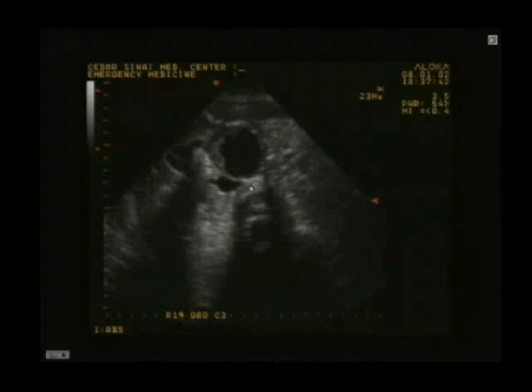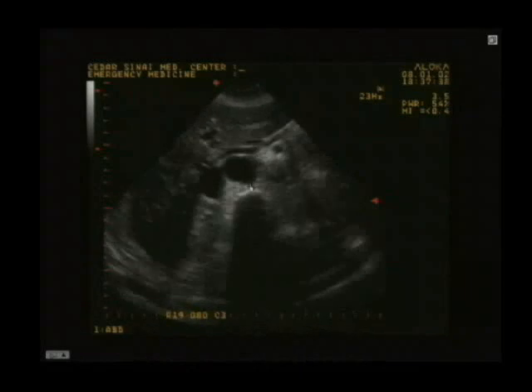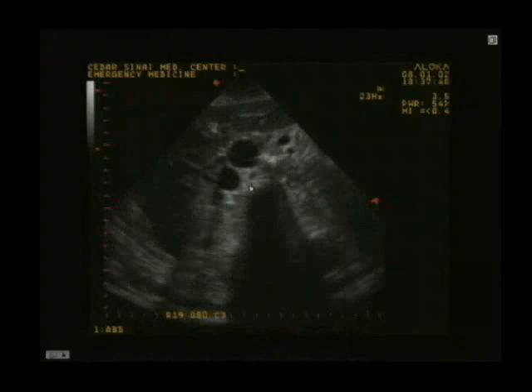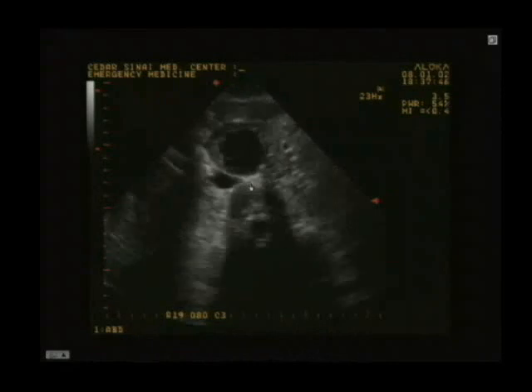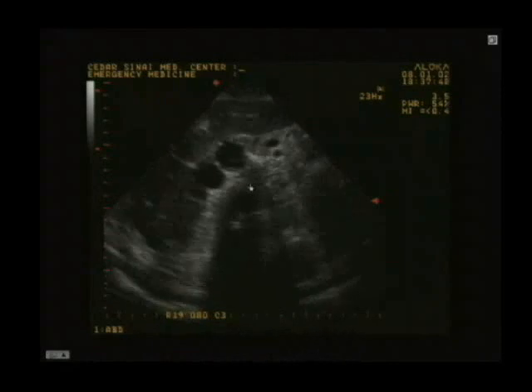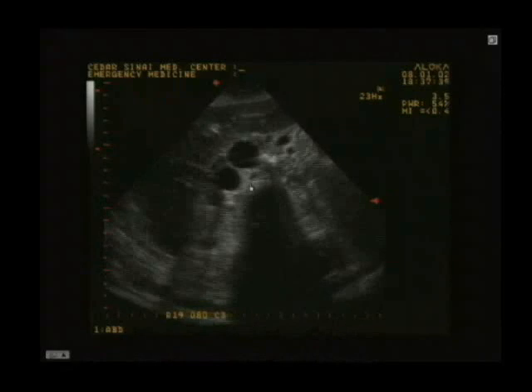And these are really satisfying cases. Sometimes these are cases that you weren't even suspecting the guy had an aneurysm. You thought there was something else going on, and then you pick this up, and this is the difference between night and day as far as this guy's prognosis. The fact that you pick this up, and he's going to have an operation, he's going to do okay. So these are really satisfying cases to detect.